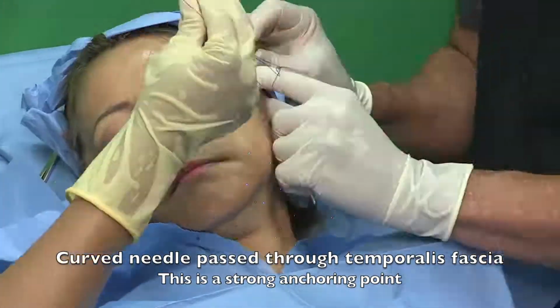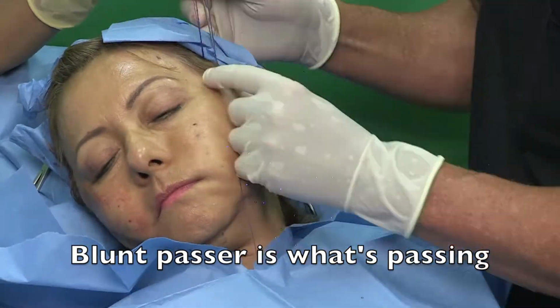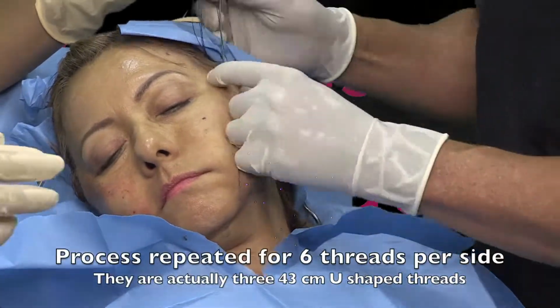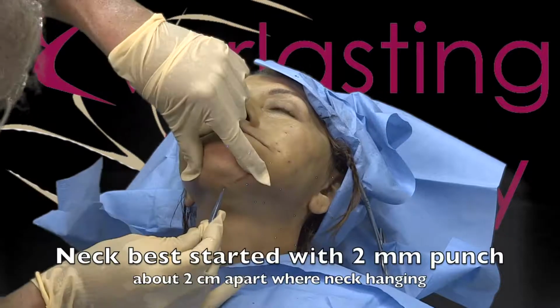First you put in the passer, then you put 3 threads through this, and then you pull the passer back through. It takes the threads with it, and then you put the blunt passer, which has the sharp passer alongside of it, and it becomes sharp just by pulling back on the blunt passer. You go from superficial, then you go deep only when you're in the mid-face.